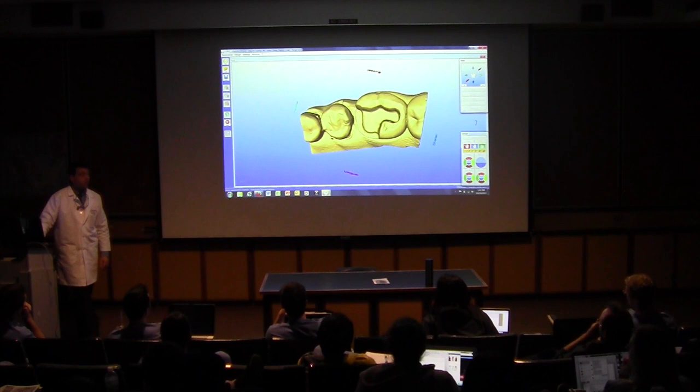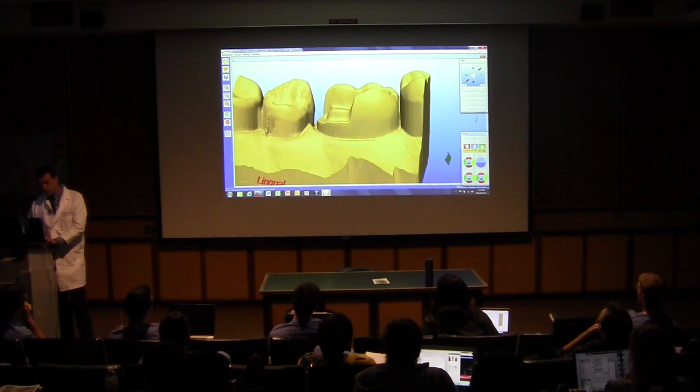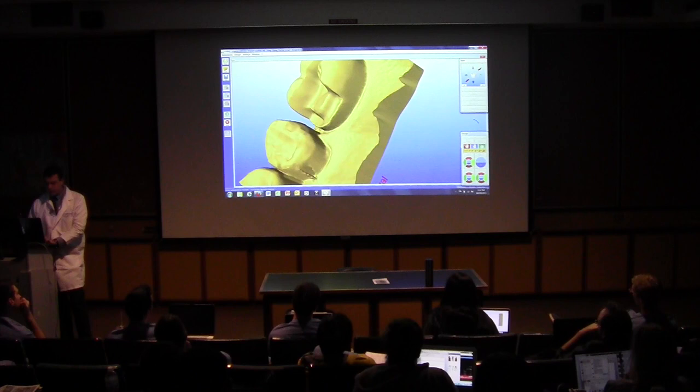Would it be interesting for you to check some interesting tools that they have here in this software? For instance, you can rotate here, you can see all the walls. Same thing we did in lab with you for some exercises. We can see the convergence walls, you can see the divergence. In this case here, this is an onlay. Okay, so things like that. So play with those files and take a look at the preps.